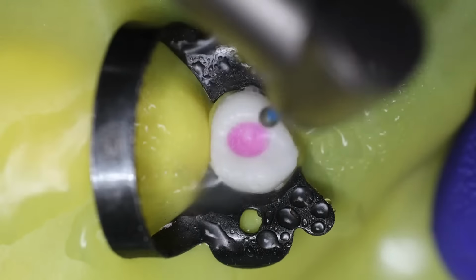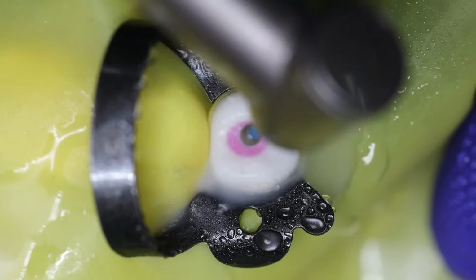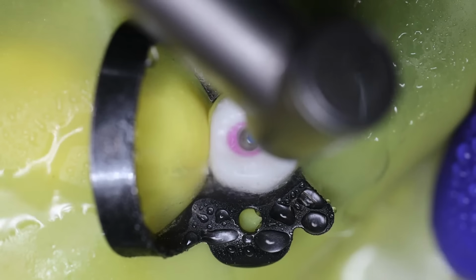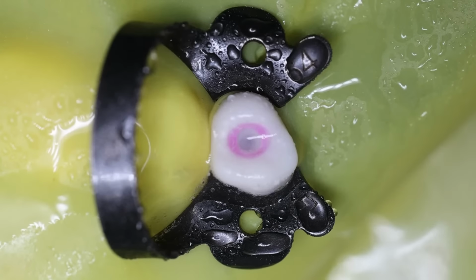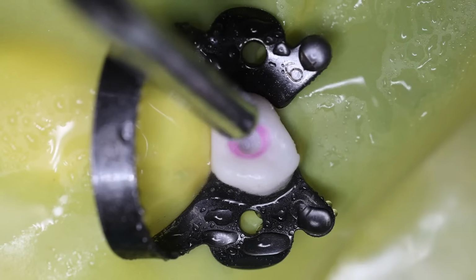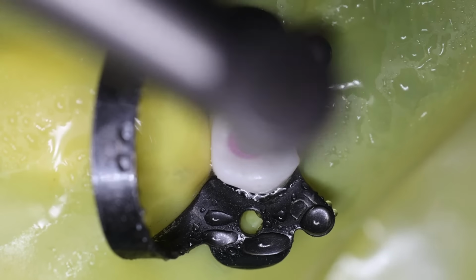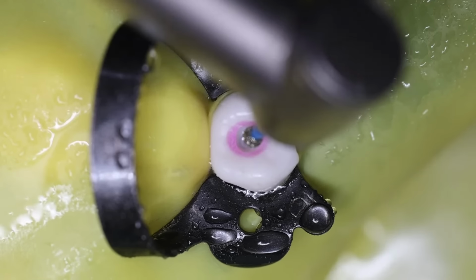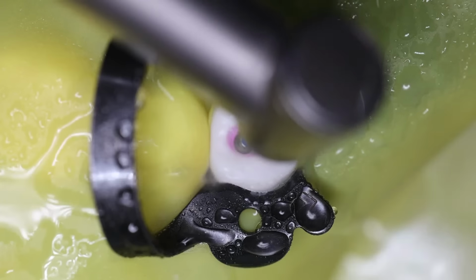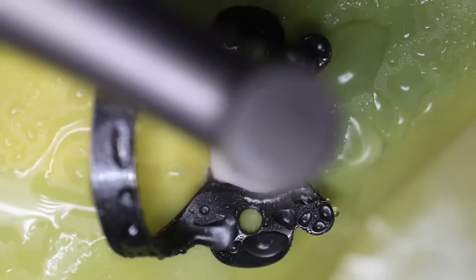We will create a central dip. You can slowly see if there is any drop felt, because you will suddenly feel a drop if you are into the roof of the pulp chamber. So just go slowly, remove the caries or the restorations that you had done. Slowly make the chamber a little wide.